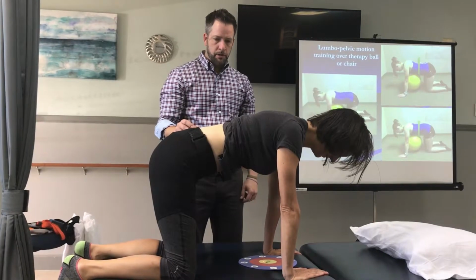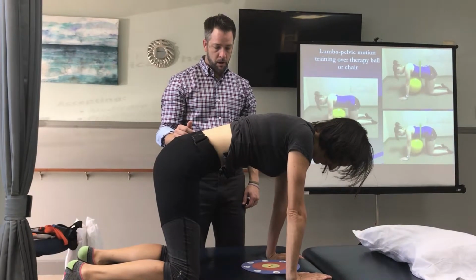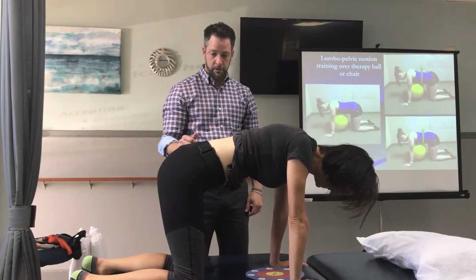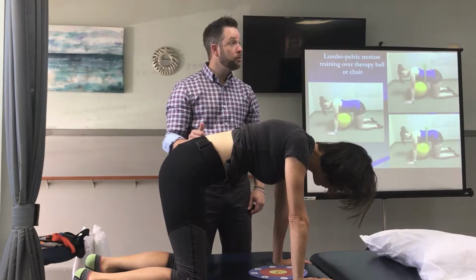But now try to get the laser to the top of the target. Don't move your elbows, or don't bend them. So top of the target. Okay. It's tough. Okay. How about bottom of the target? Okay. So she was moving before.